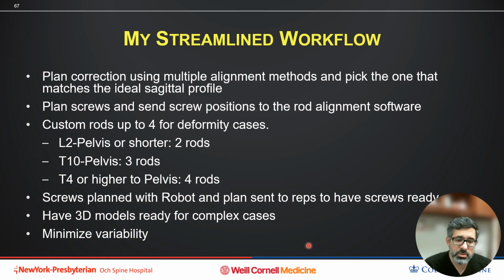So overall, my streamlined workflow for performing a patient-specific plan and construct involves initially understanding the reason for the surgery, what the surgery is going to be, deciding which alignment methodology I'm going to use for that specific patient, and I use different ones based on the patient. Planning the screws, I send that screw plan to the software engineers for the rod software, so they can merge my screws and rod planning together to make the rods that I want to get.